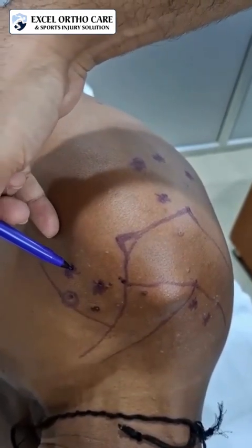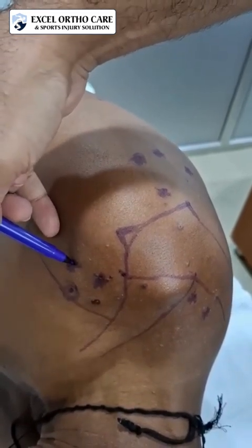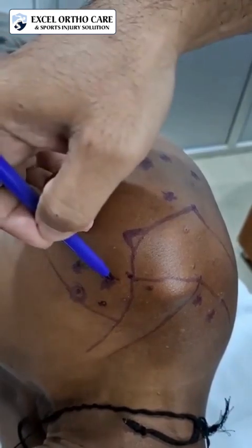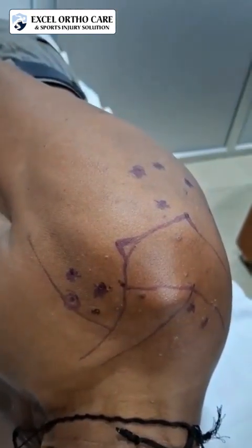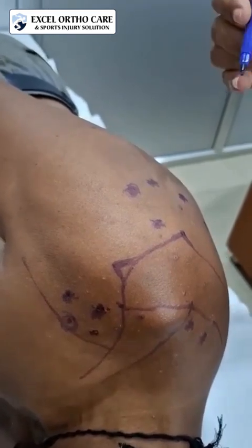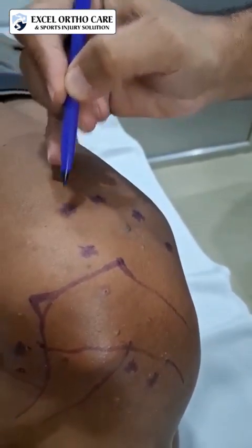This is the anterior portal. It is at the level of the coracoid process and it is 1 centimeter lateral to the coracoid process. The anterosuperior portal and anterior portal both are used in the Bankart repair. The next portals are the posterolateral portal and the lateral portal.